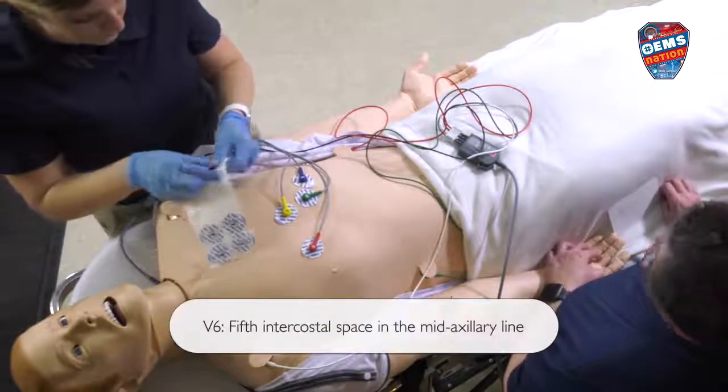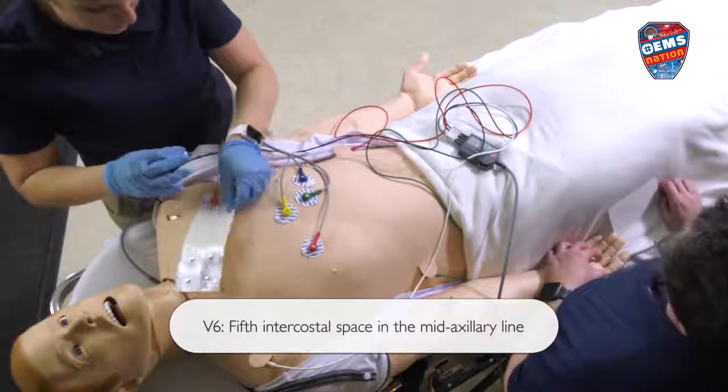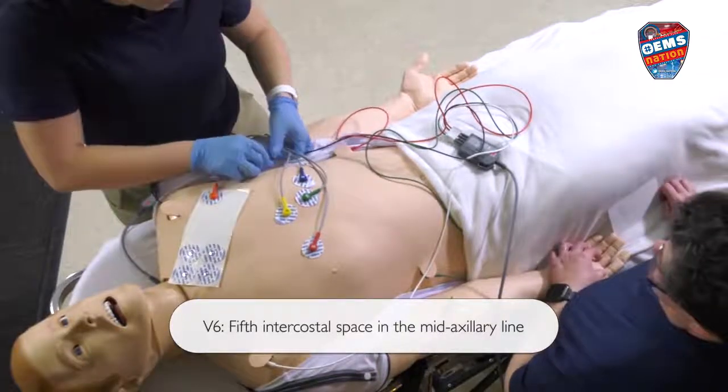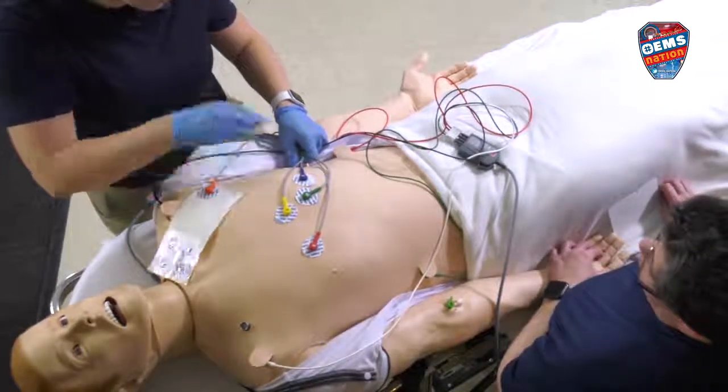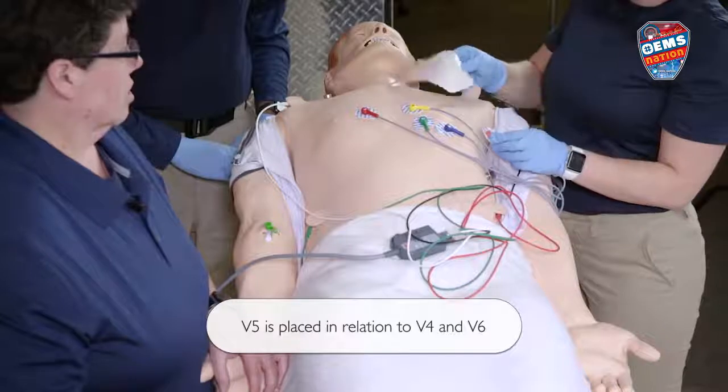We're going to put V6 at the mid-axillary line — the imaginary line down the middle of the armpit — in the fifth intercostal space. And then V5 is going to go between V4 and V6.